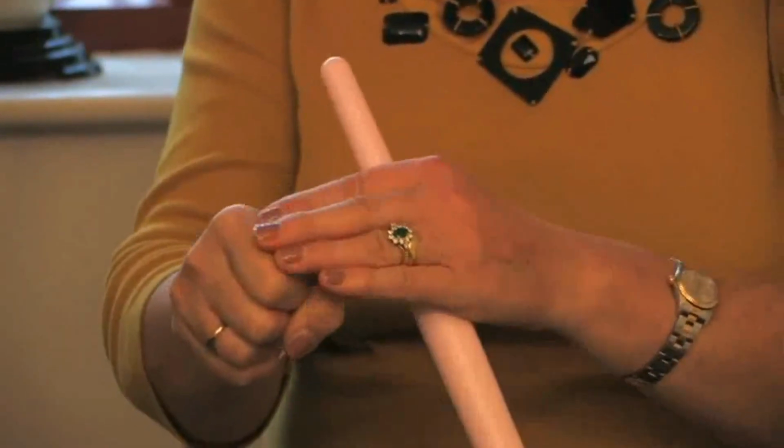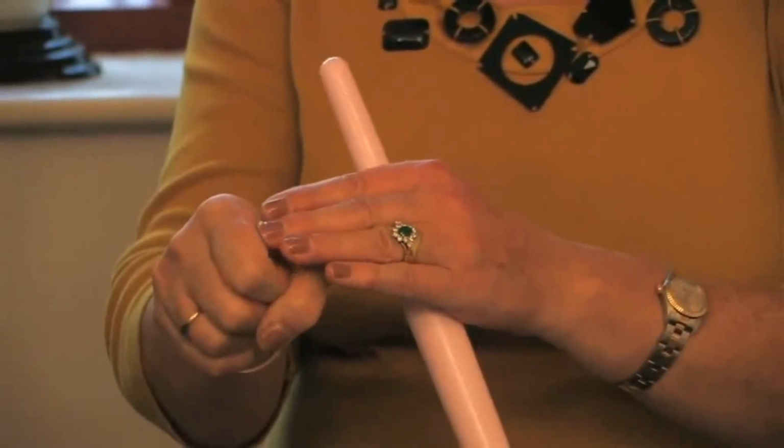She then, I'm going to be using my hand to symbolise a vagina. She just puts lots and lots of lubricant on the outside of the vagina and just a little bit at the entrance, just like that. So there's plenty of lubricant.